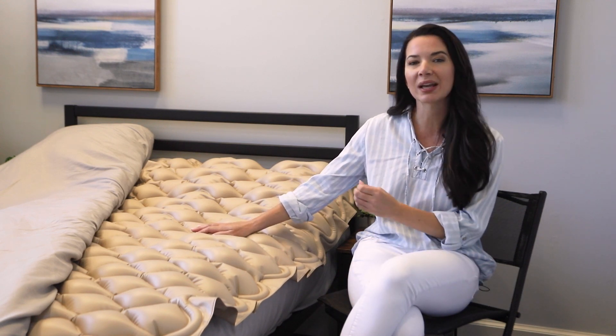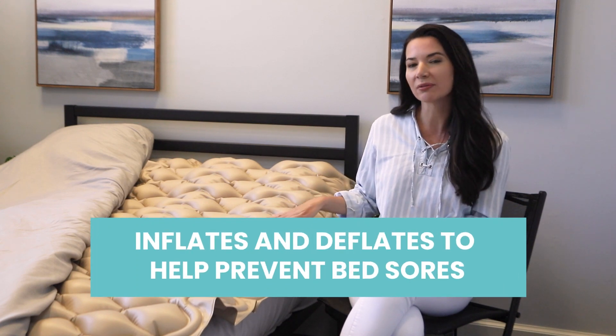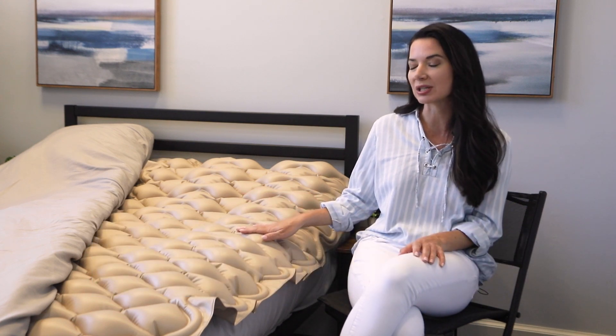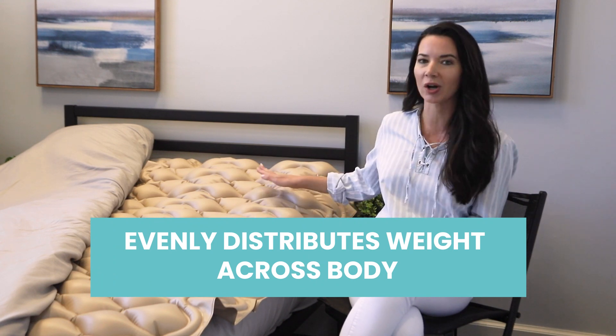This innovative and advanced mattress system is designed to provide relief while inflating and deflating air pockets for greater comfort. With alternating air pressure technology, this mattress helps to evenly distribute weight across the entire body.